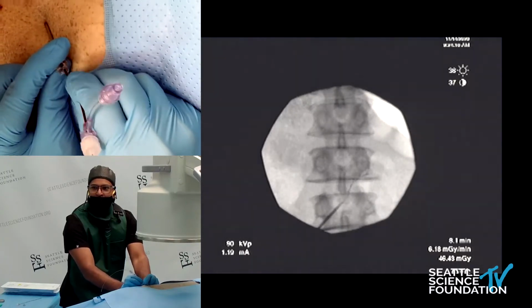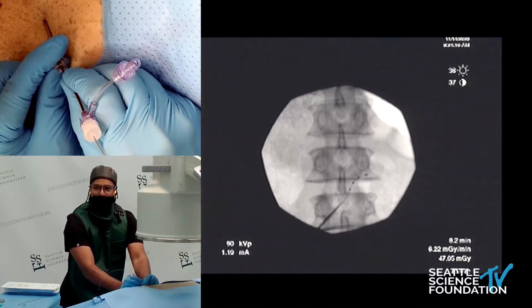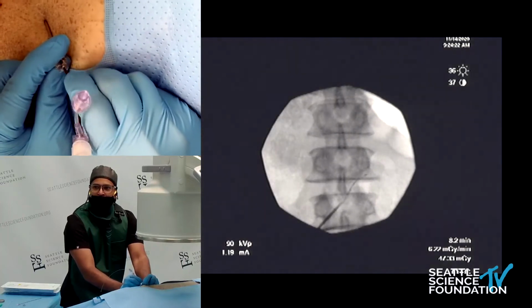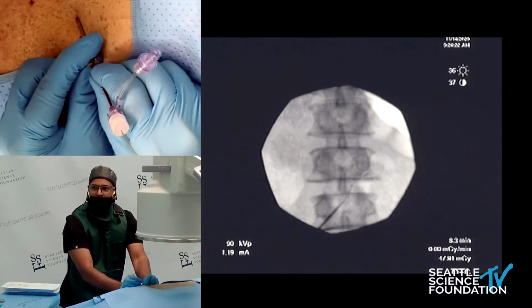You don't want to be too overzealous, because what you don't want to do is put so much pressure on that it starts to kink the sheath, okay? So you really want to just maintain the sheath, and you can see it's curving up a little bit, and I'm twisting, and eventually we'll get there.